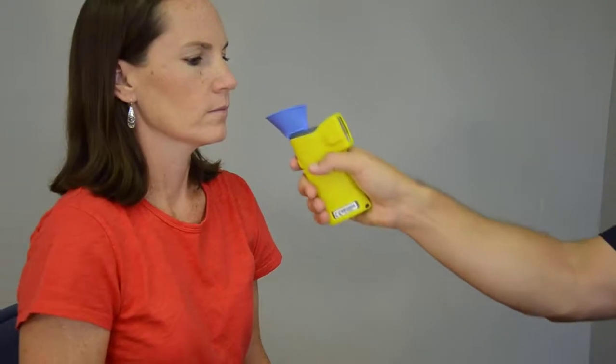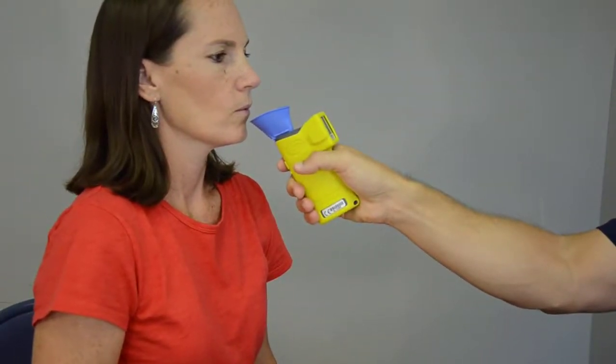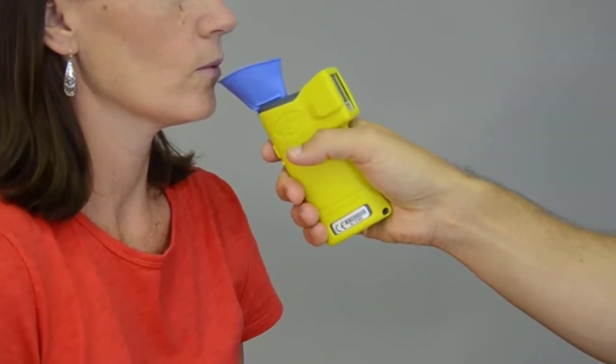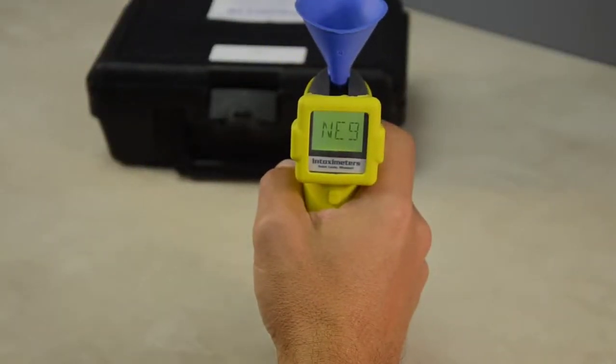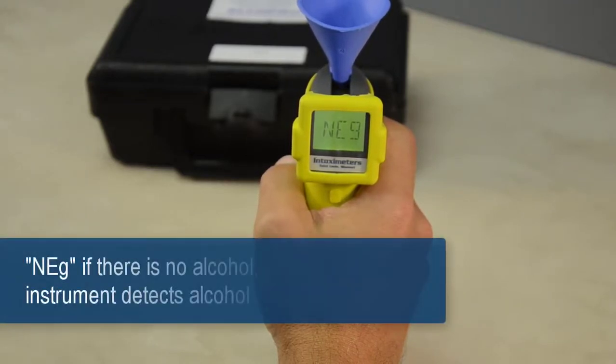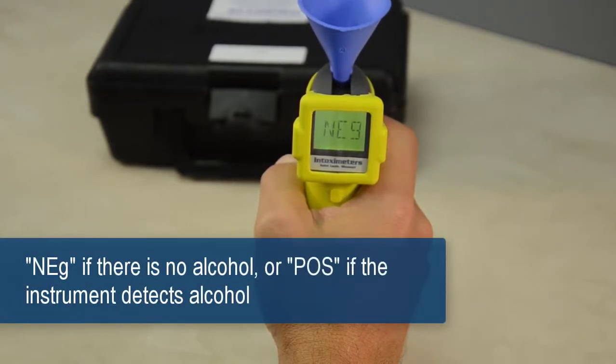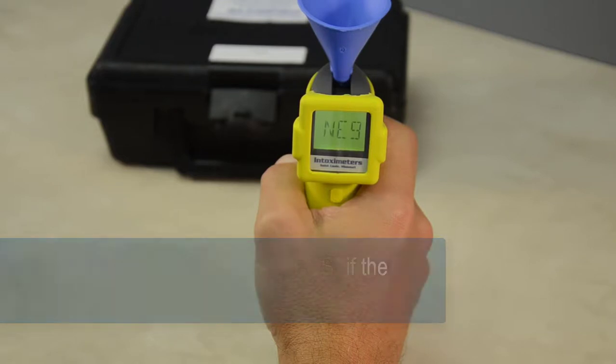Hold the AlkaSensor FST several inches from the subject's mouth and instruct the subject to blow into the cup. The AlkaSensor FST will automatically capture a sample of the subject's breath and display NEG if there is no alcohol present or POS if the instrument detects alcohol.